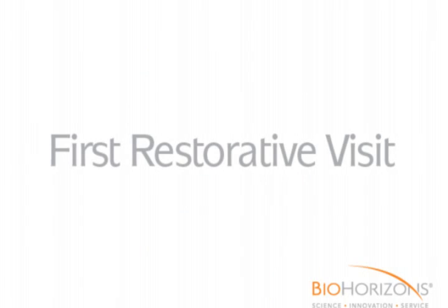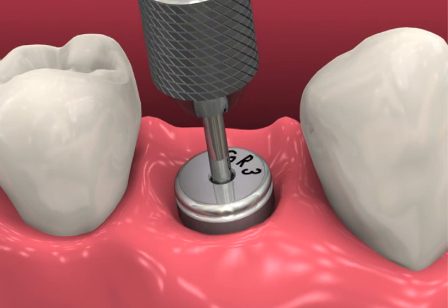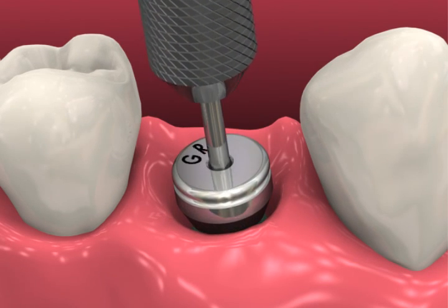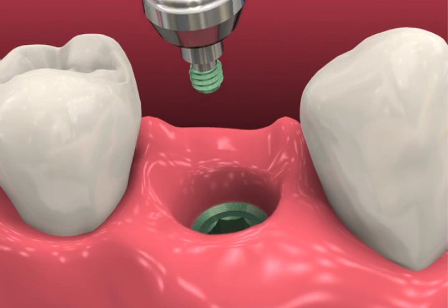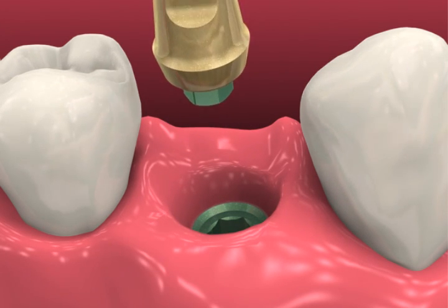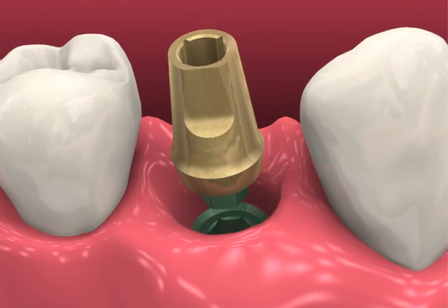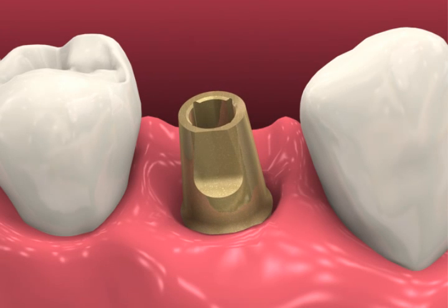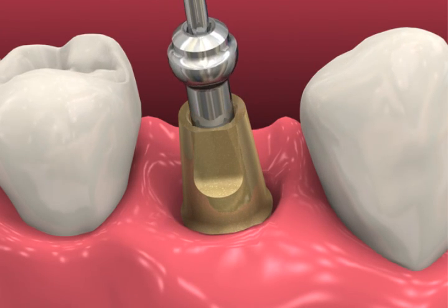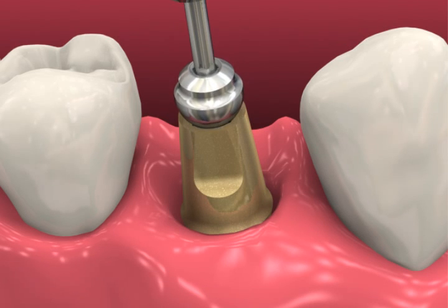At the first restorative visit, unscrew the healing abutment with an 050 hex driver. Irrigate the prosthetic platform to remove any debris and dry thoroughly. Seat the 3-in-1 abutment in the implant's hex. Both the abutment and implant platform are color-coded to ensure proper component mating.